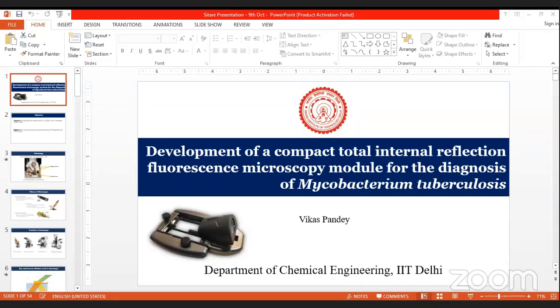Some of the false negatives could be because of artifacts. Sometimes the background generates a signal which looks like bacilli, or the bacilli do not take the proper staining, so they are not shown or do not generate a signal, and it looks like there are no bacilli in the frame.